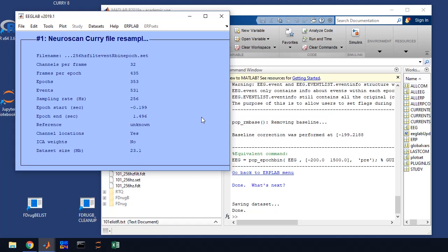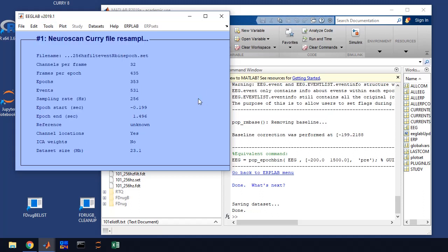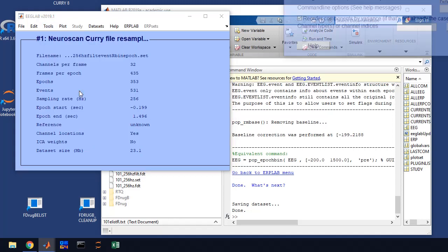So how do we do that? Well, the first thing that we're going to do is go to tools and decompose the data by ICA. As you can see, before I run this, the ICA weights say no. The first thing we have to do is basically compute the ICA weights or independent components analysis is what ICA means.